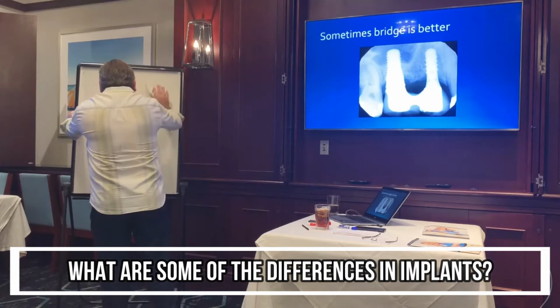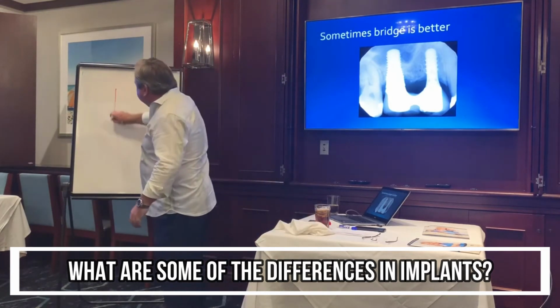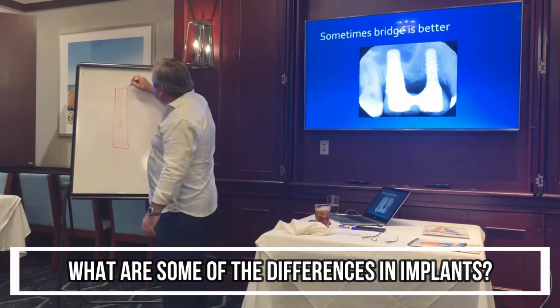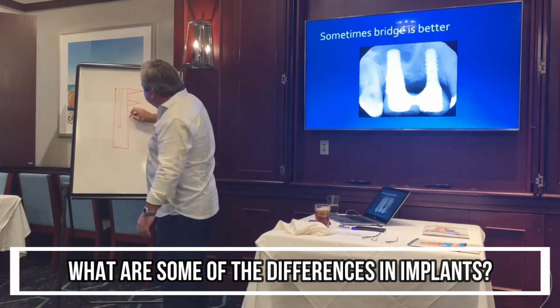There is no three-rooted implant. Every implant is a cylinder with threads. It has a hole in the middle that holds the screw. And there can be threads, and you can have lots of threads. You can have a few threads. Every implant manufacturer is different.